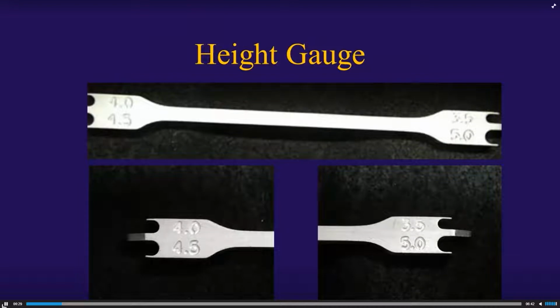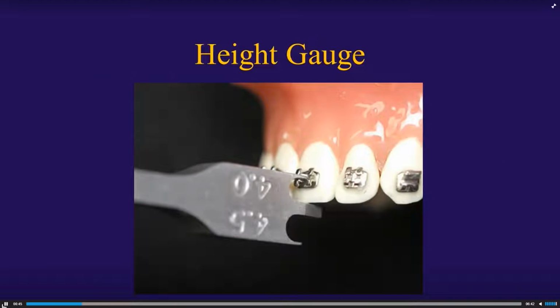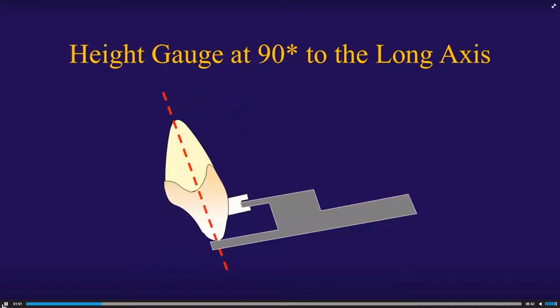Now, in order to set those precise heights, we use the bracket height gauge. This instrument has the four most commonly used orthodontic bracket heights: 3.5, 4, 4.5, and 5 millimeters. How you use this gauge is you place the flat part, that big fat part, right on the incisal edge. And then that thin tine with the measurement you want goes right into the bracket slot. Now, when you're using this gauge, you want to make sure that you have it set to about 90 degrees to the long axis of the tooth. You don't want to tilt it way down low or way up high, because that can alter the bracket height on the tooth.